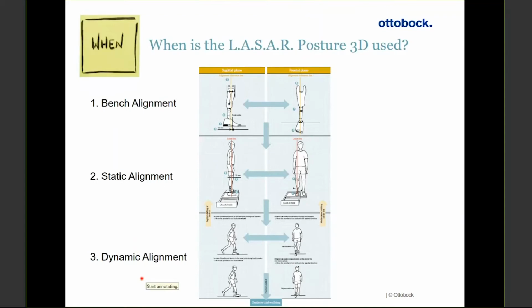We take into consideration things like heel and forefoot levers, the material, all sorts of things. So please follow the bench alignment guidelines from the manufacturer. I'm not going to go into too much detail about bench alignment. What I will do is provide you with these posters here in a PDF format of transtibial and transfemoral alignment for you to look at later.